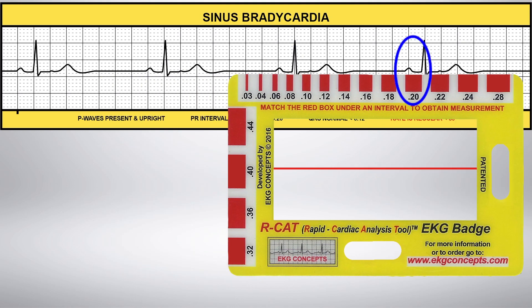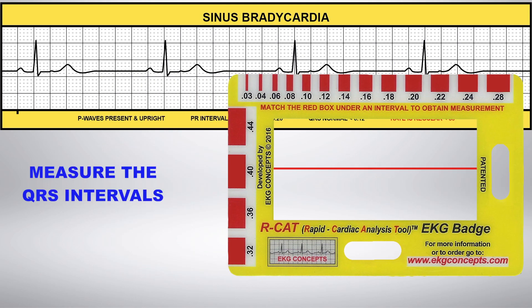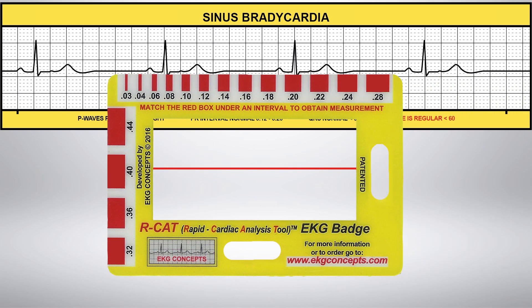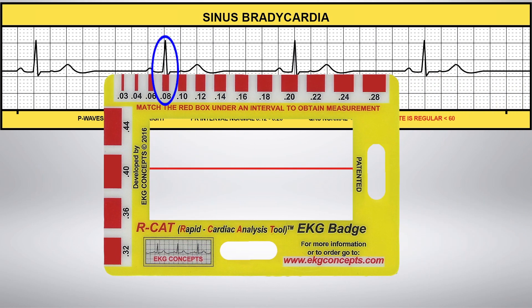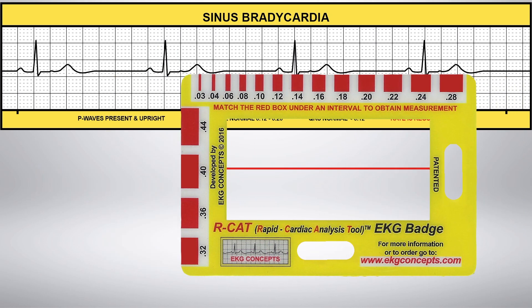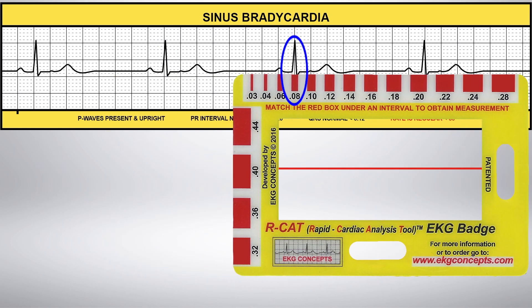Now measure the QRS intervals. The QRS is consistently .08, putting it in the normal range of less than .12.